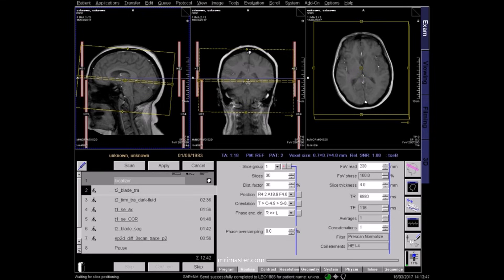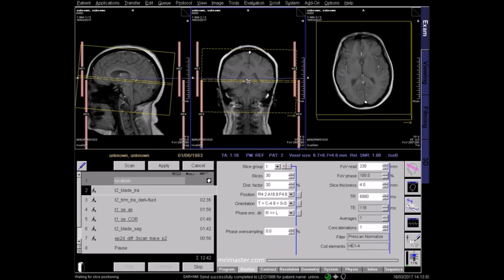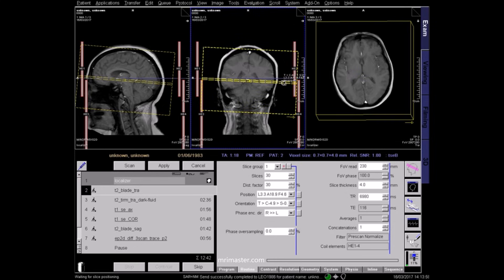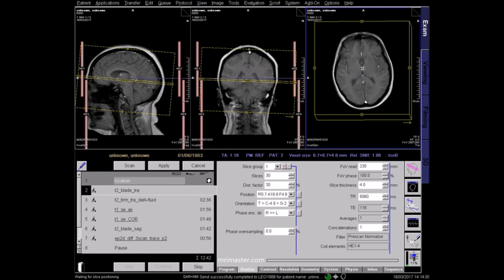On the coronal localizer, the central slice should pass along a line from the superior sagittal sinus, through the third ventricle, and down the centre of the brain stem. Center the axial localizer in the field of view, and apply.